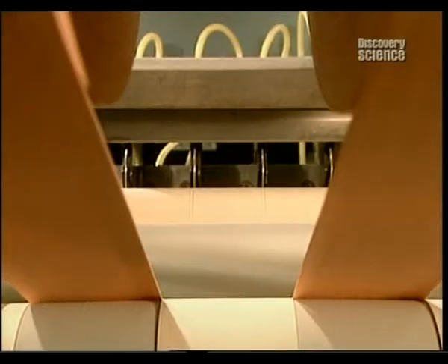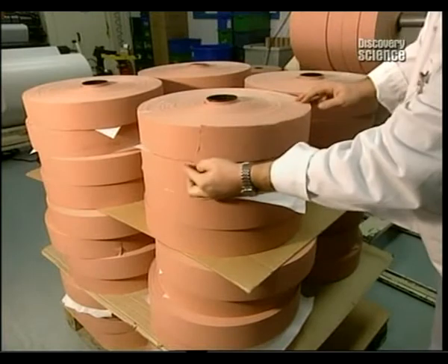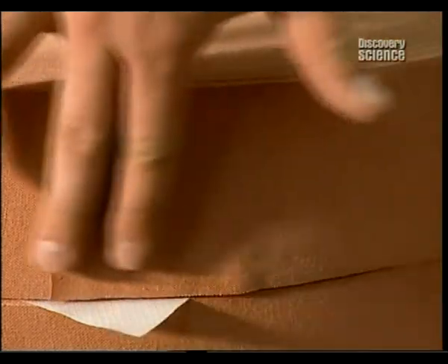Bandages are of different sizes. These blades cut the glued rolls into strips of varying widths. These rolls are then stacked, ready for the next step, application of the little cushioned protective pad.